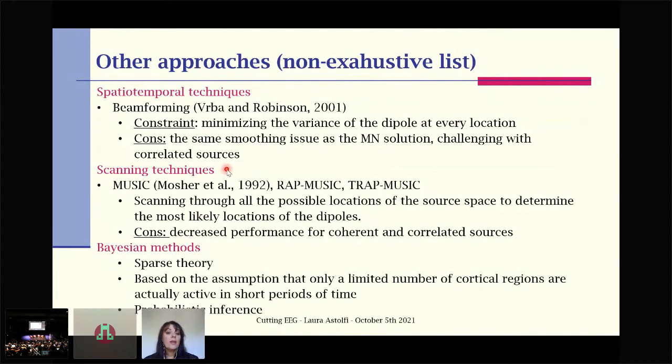Other techniques are based on the scanning of all the possible locations of the source space to find out which is the most likely. So again, a different approach, different methods based on this. Again, particular care must be taken when coherent and correlated sources are observed.